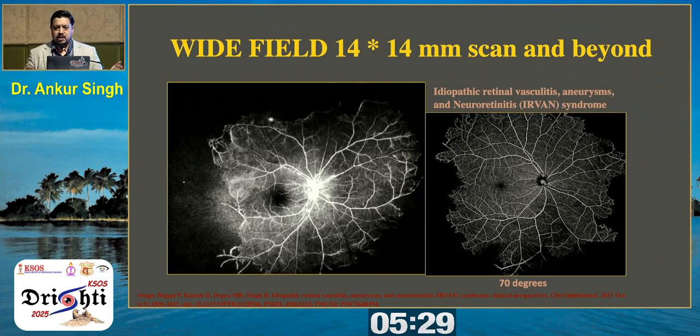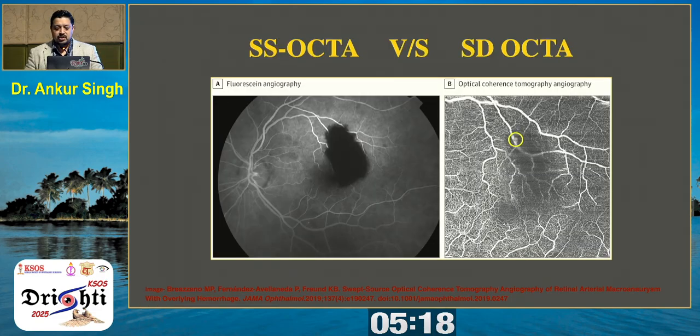So with the DREAM OCT coming up now and ultra widefield OCT, you can even tap into the diseases which were only limited to ultra widefield angiography, like Eales disease. So we literally see Eales disease with OCT angiography.